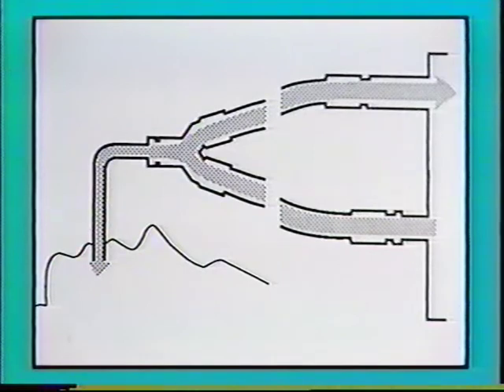Flow triggering uses a small, continuous expiratory flow. When the patient inspires, the flow is diverted to the patient, decreasing the flow returning to the ventilator. The expiratory flow transducer senses this and transmits a message to the gas module to open the valve. The sensitivity of the flow trigger determines how much flow must be diverted to the patient to initiate a breath.